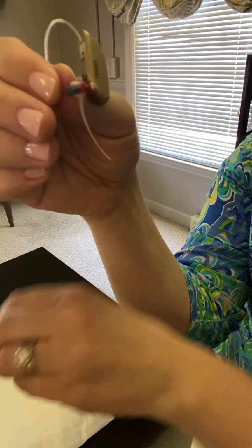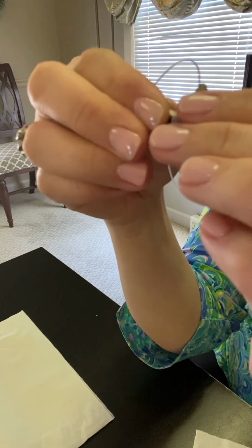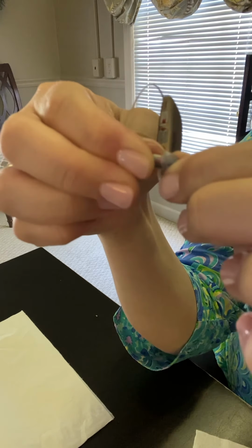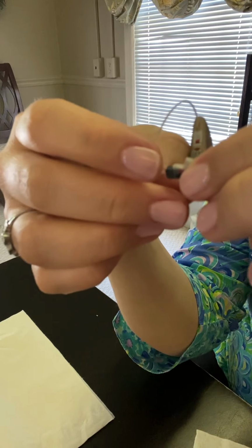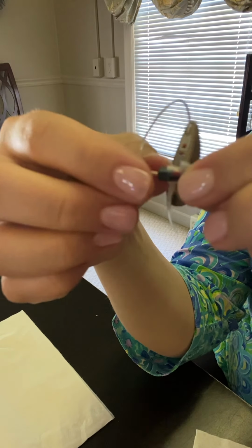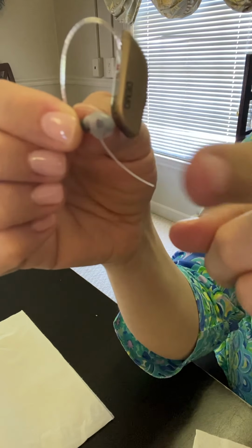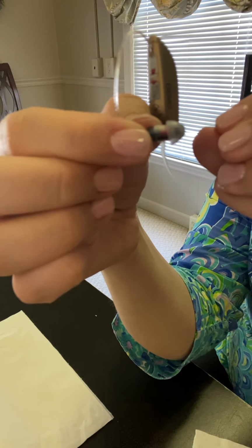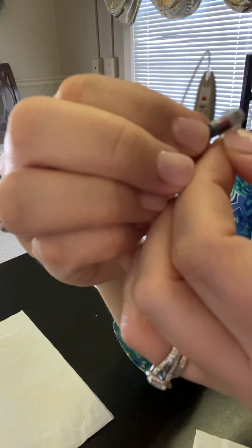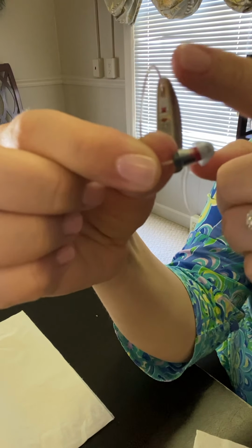Then when you slide your dome on, so again, you line it up with that little hole and then slide it on, push it, give it a tug to make sure it's on all the way, and then push it on again. That way your retention lock is all the way on and your dome can lock securely in place. If your retention lock slid out at all, then the dome cannot be as securely attached as it needs to. So make sure the retention lock is in as far towards the wire as it will go.